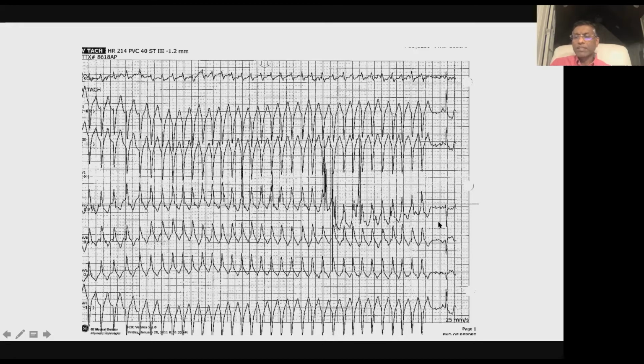It seems to break, correct? Yes. Okay. And then there seems to be a pattern like an atrial flutter kind of pattern, the sawtooth. Yeah, so that's the problem of looking at telemetry strips. When you look at tele strips, all these little fuzzy things over here are just noise. That's not any kind of P wave. That's just electrical noise, artifact.